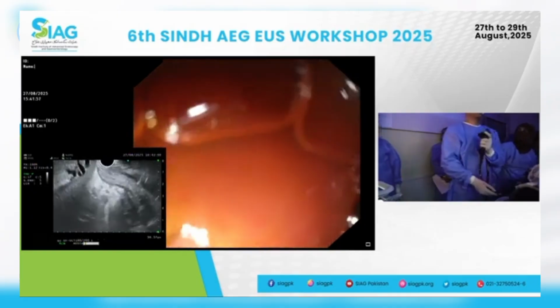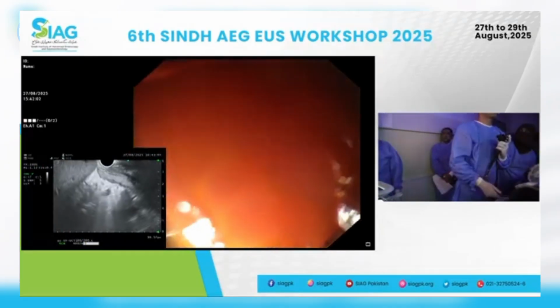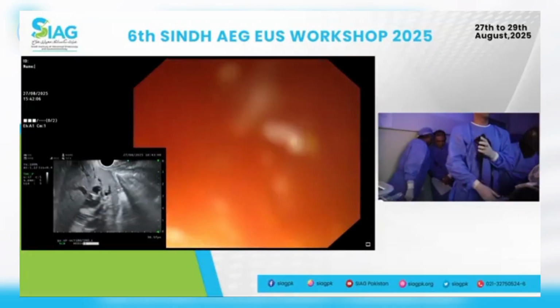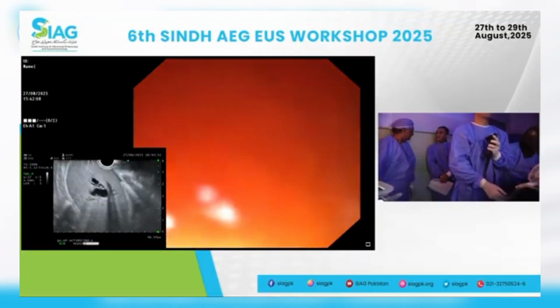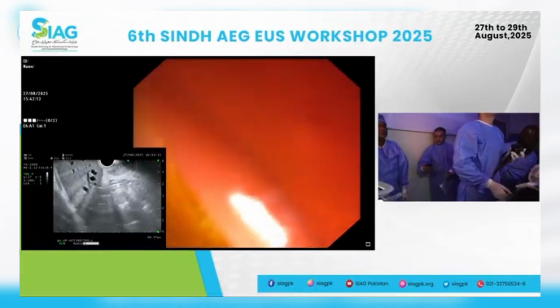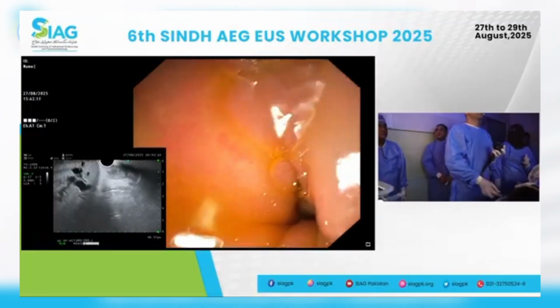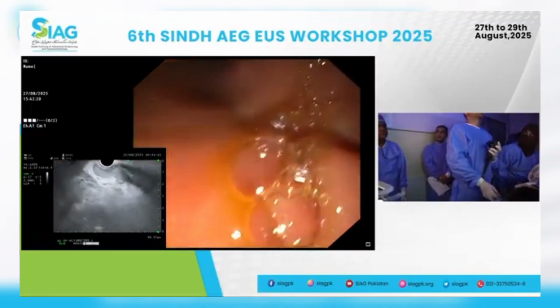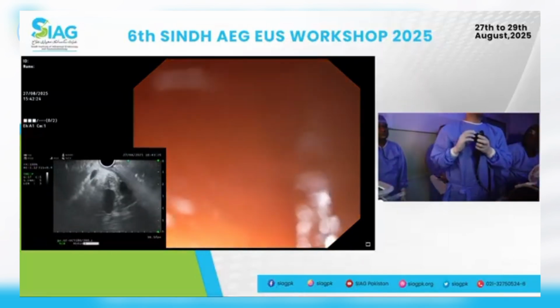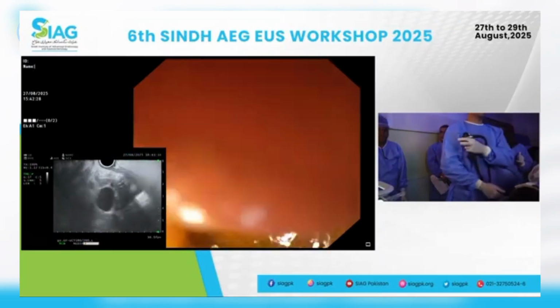So remember, as Dr. Hassan said this morning, sometimes what you have to do is use a small wheel to the right just to align it. And it should land. Yeah, you're on the front. But it is a bit narrow. Yeah, I think it's just the position. So I should not be sort of forcing my way in. It should go in nicely. That's it.